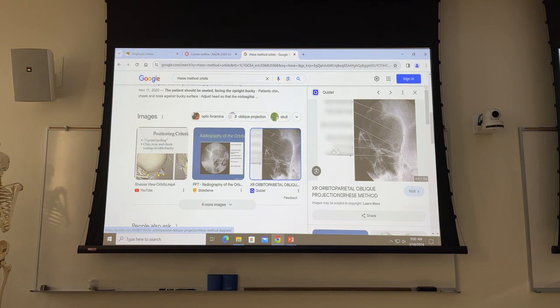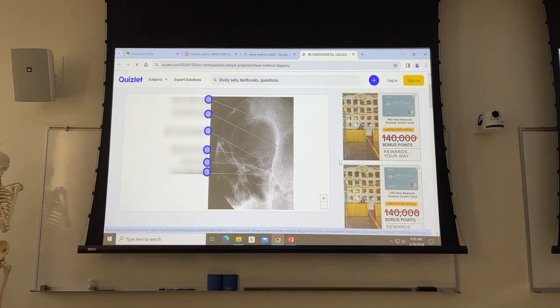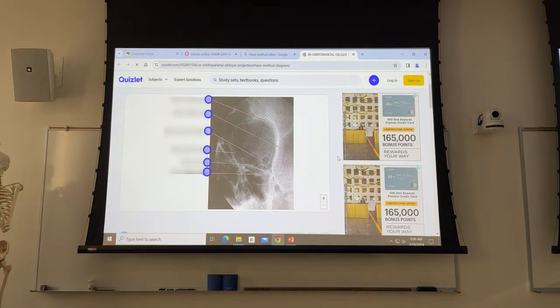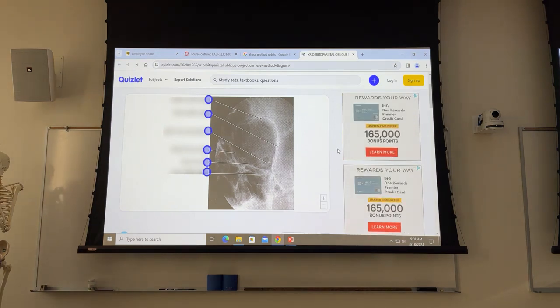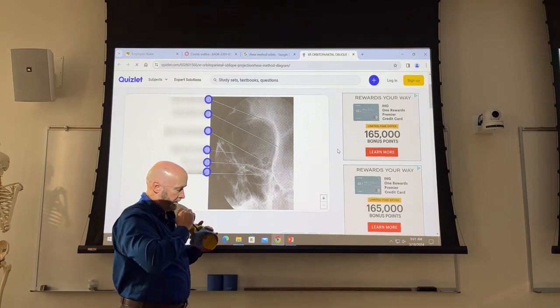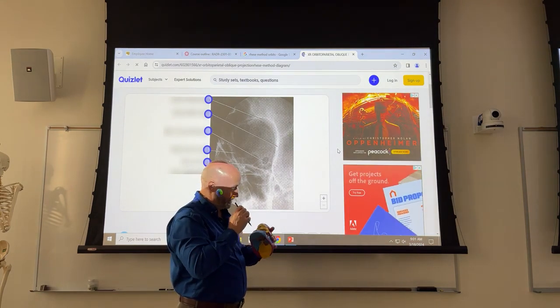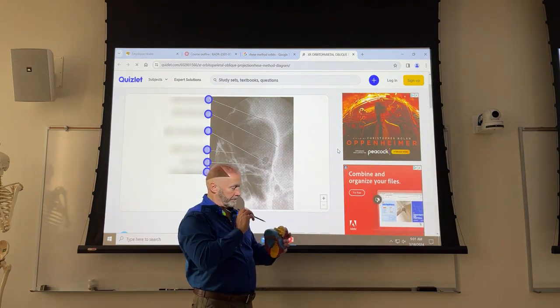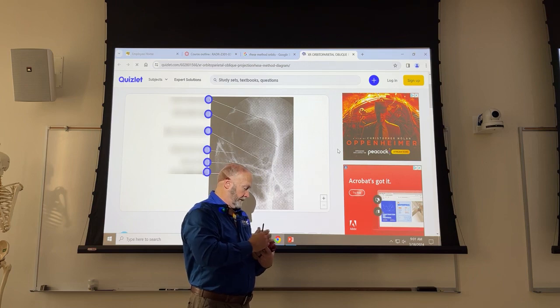So, Rhese method is a double angulation on the skull. So, what you're going to do is start off kind of like a 37 Waters. Don't do this to your patient, by the way. But the Rhese method, the purpose for the Rhese is to try to put the central ray parallel to the optic canal, which is what I've got going on here.